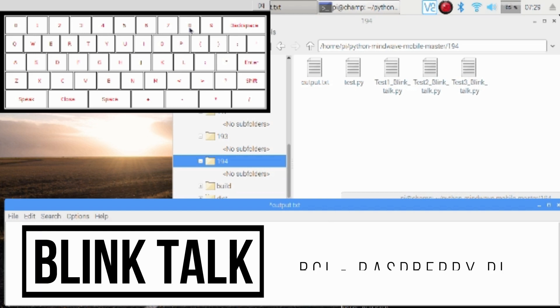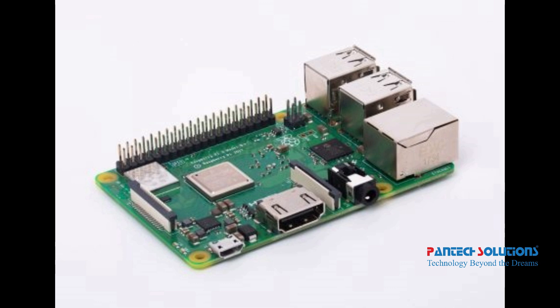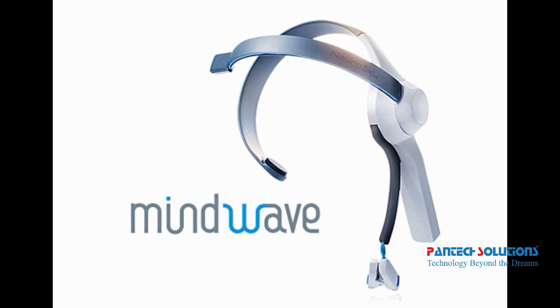Hi, welcome to Pantech Solutions. Today we are going to see Blink Talk using Raspberry Pi with Mindwave Mobile BCI.